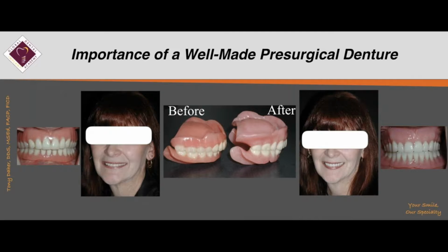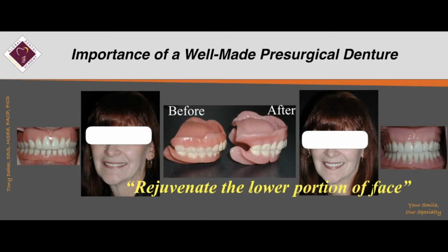So when you look at the before and after dentures here, if you want to place an implant according to the old mandibular denture, then the angulation is going to be this way and be situated between the two flanges of that denture.